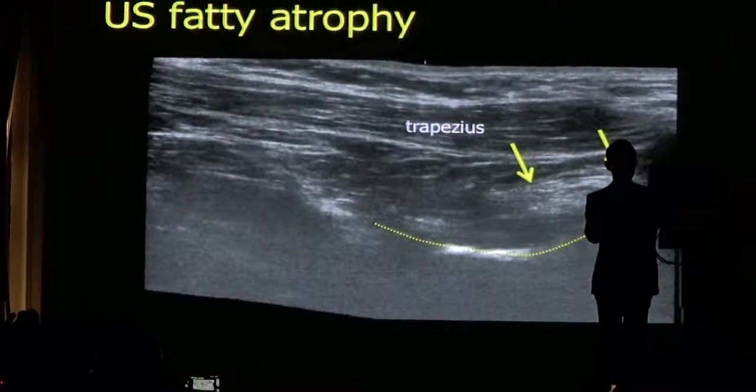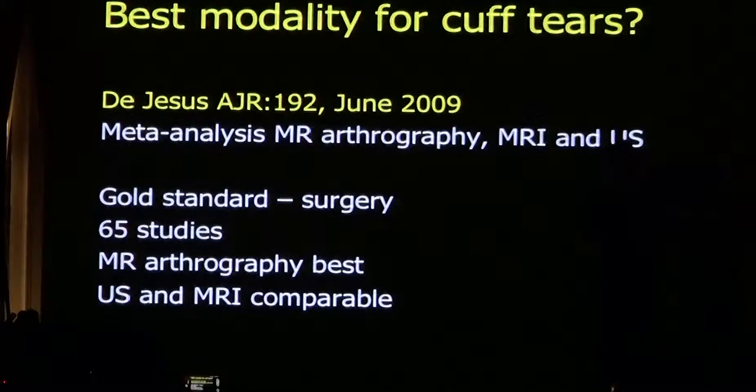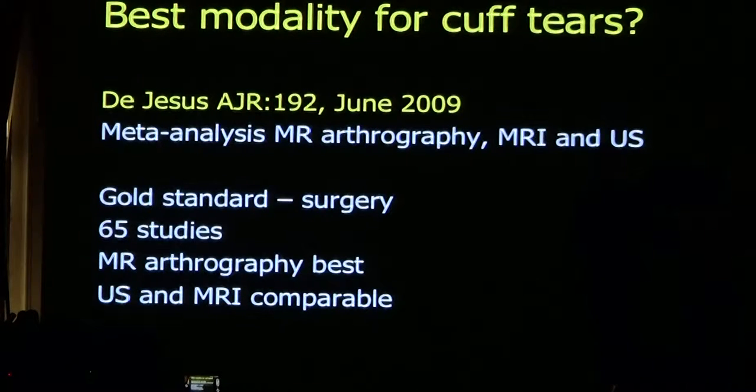And again, just in the other plane. So what's the best modality for cuff tears? Well, depending on where you are in the world, if you are in the USA, they will tend to use MRI or MR arthrography for diagnosing tears.